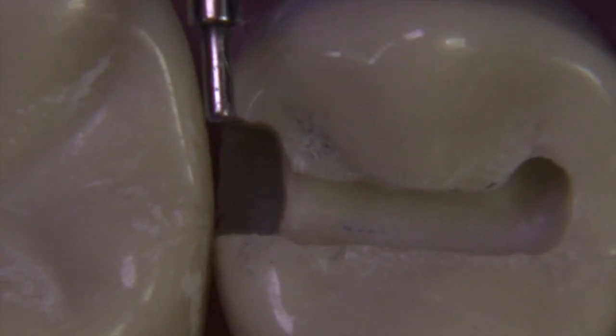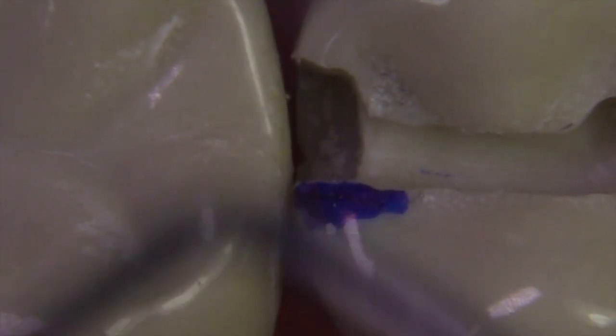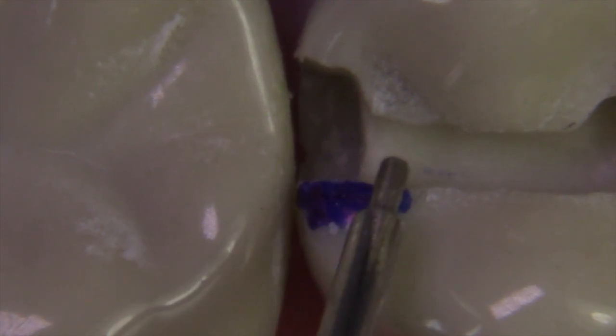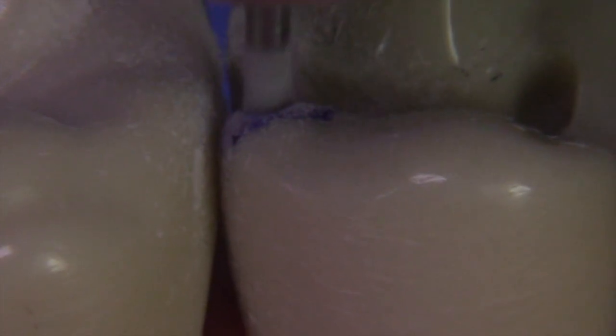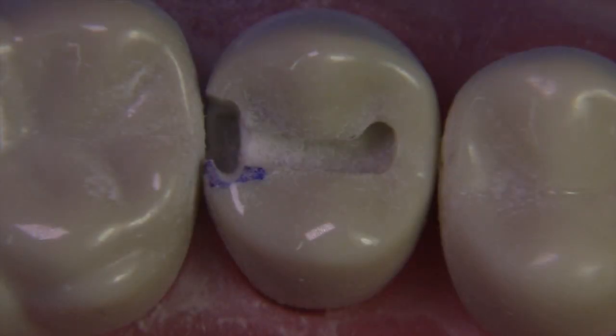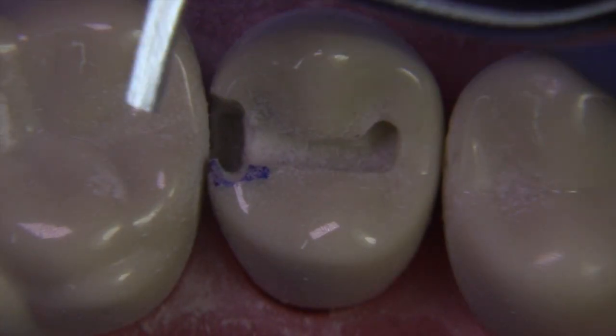Even though we don't have adequate clearance yet, always maintain the proper exit angle. The 0.5 millimeter — or at least 0.3 millimeter — clearance objective is not yet made; we need to extend further. We're going to use the 245 burr chopping down from the top, working our way down to create a concave crescent shape on that lingual wall, which creates a little area of undermined enamel — that beak out towards the contact area. If the beak is too thick, go back in with the burr and make it a little wider mesiodistally so the beak is easier to remove.